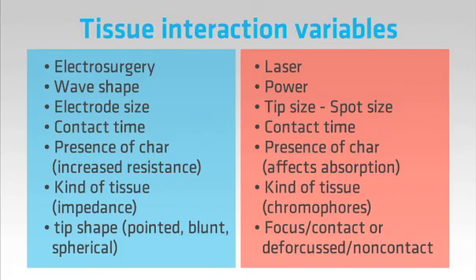With electrosurgery, we need lots of different shaped tips. With the laser, we can use a simple tip and just change how we initiate it. We can shape the tissue by delivering more energy in one place versus another. It's just like sculpting.